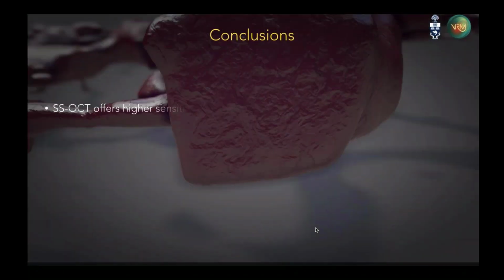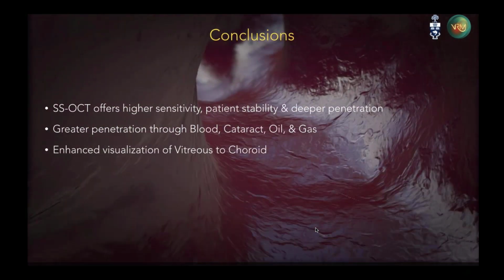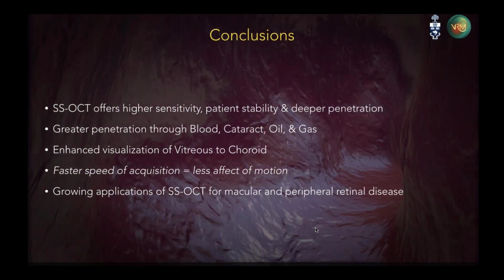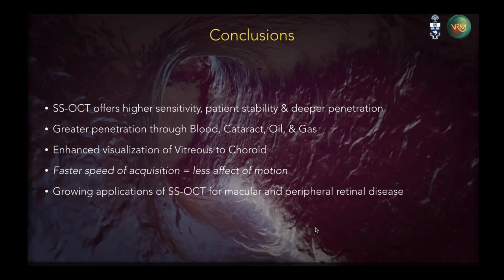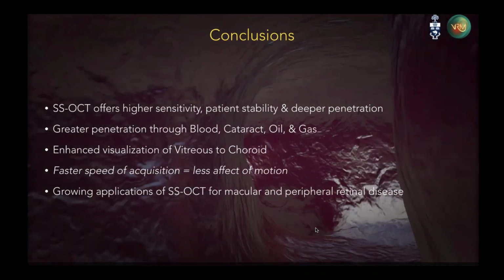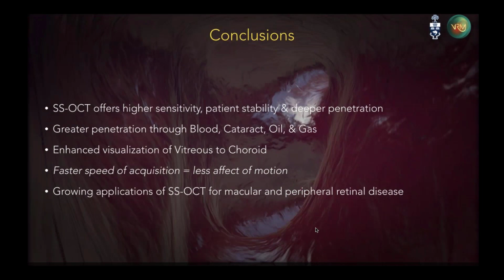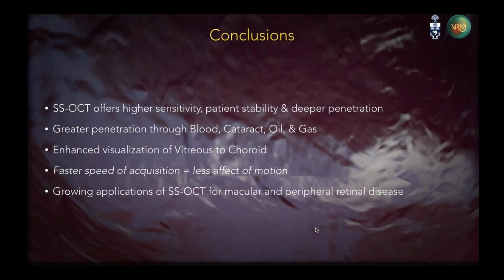And really, when you think about where we're headed, this is actually another example. This is the same conclusions, but just to further highlight the fact that we can get great information. This is a patient of mine with a choroidal neovascular membrane, and I work with Carl to sort of render this together so we could do a fly-through of her blood vessels. And you can see, it's really a significant wow factor for us to look at disease in a way we've never looked at it before, which is really from the inside out. So, this is just something we have not done before. We're in uncharted waters, and it was only really possible through a device like Triton and Topcon's forward thinking.